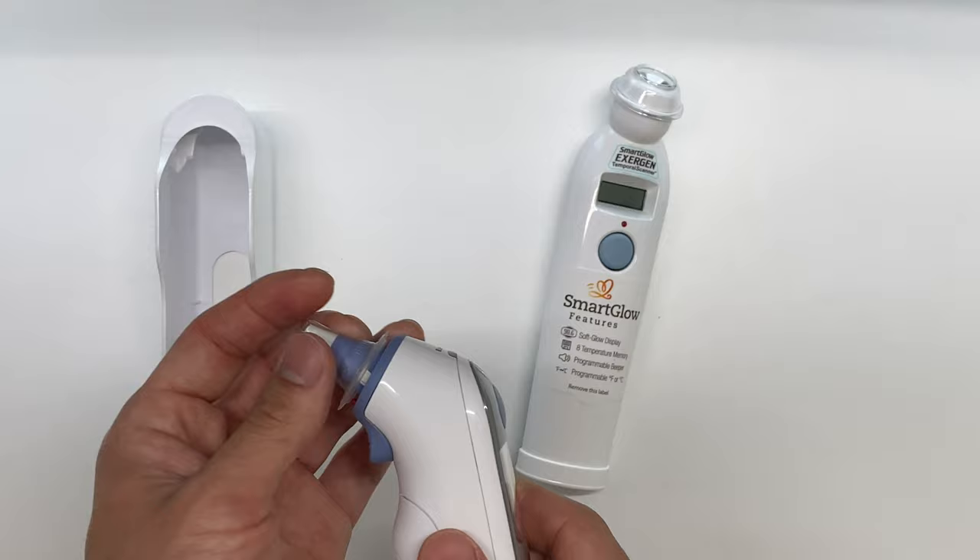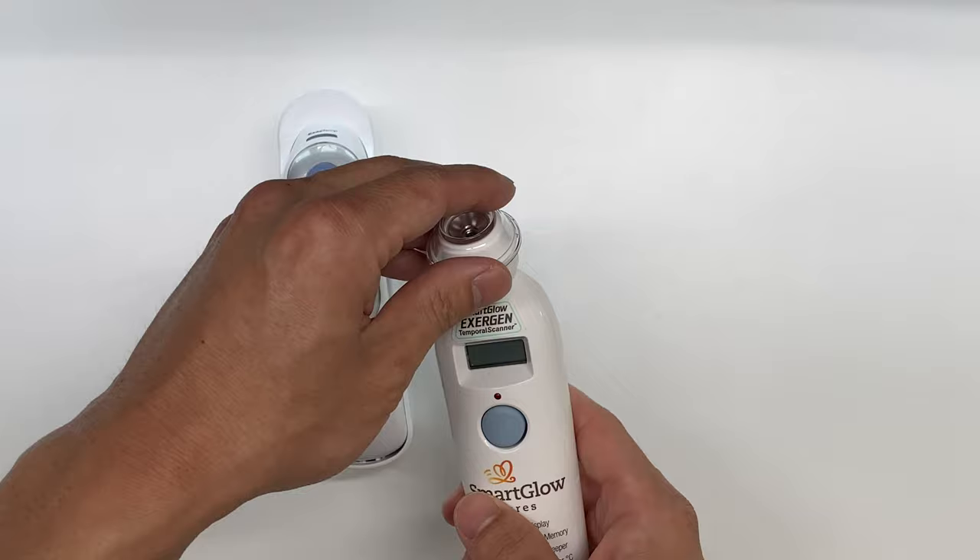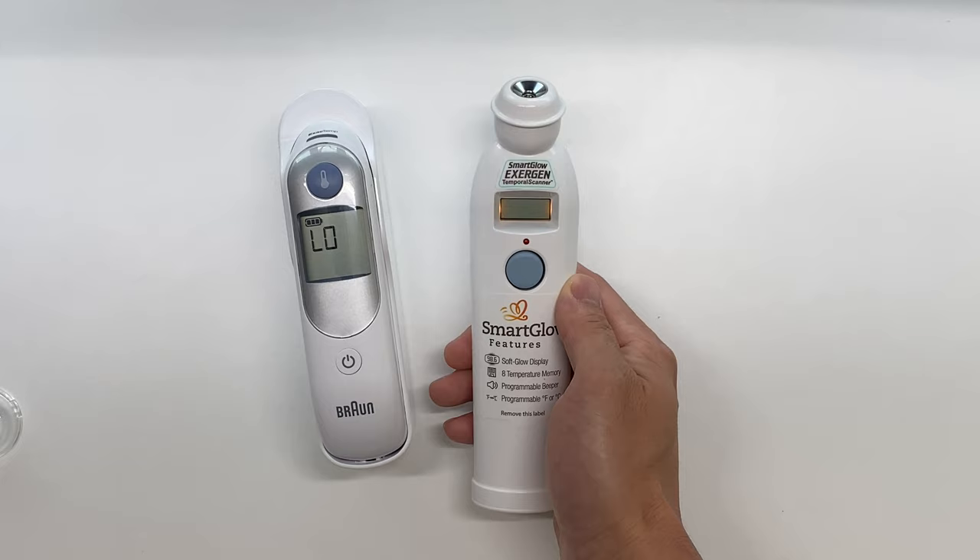Now let's go ahead and take a look at the Exergen. We're gonna go ahead and take off the cap here. We simply press this on our forehead — first we're gonna power on the device. That also gives us our last temperature reading we had.